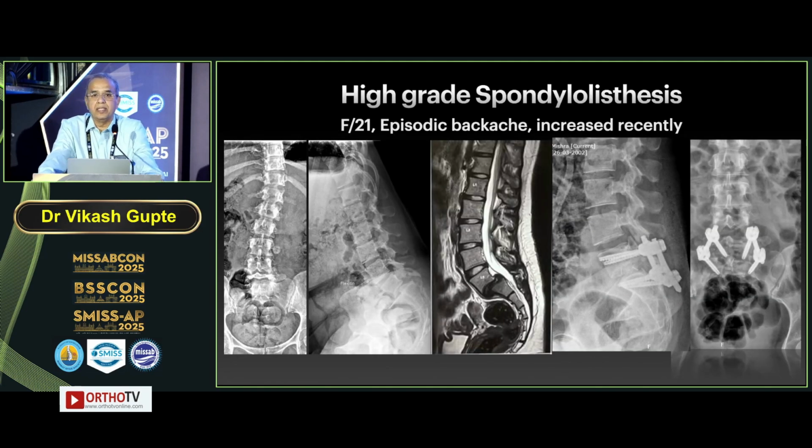High-grade spondylolisthesis: with proper techniques, you can reduce high-grade spondylolisthesis. This is a 21-year-old girl done recently, with complete reduction.